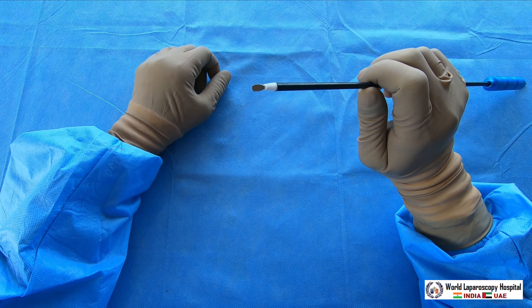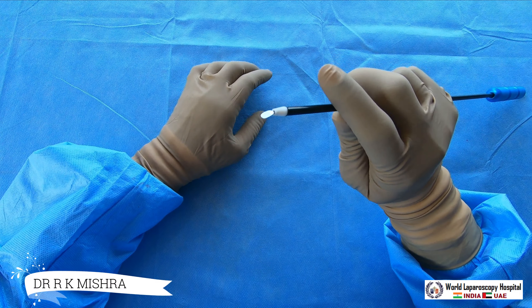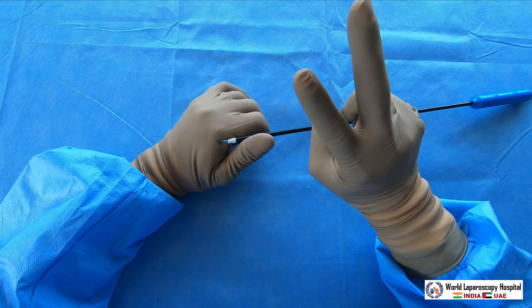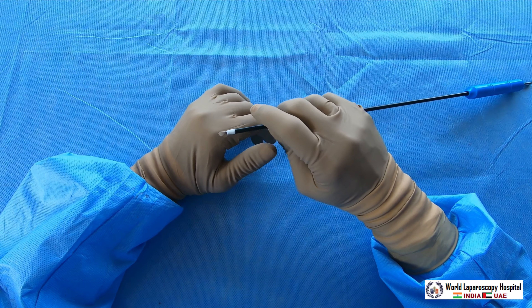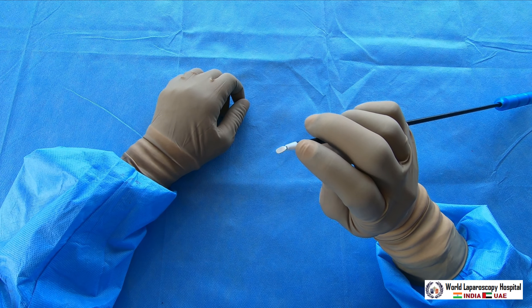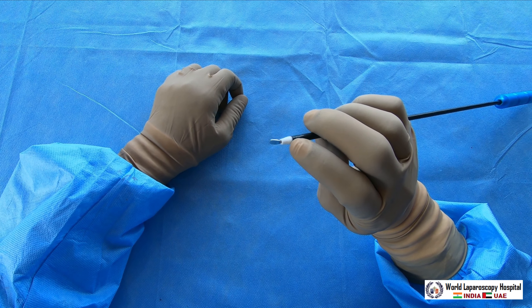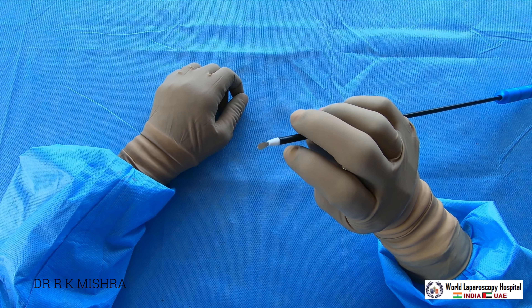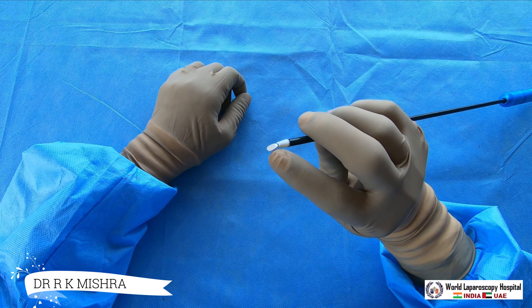Many times when you have bleeding from the bed of the gallbladder, this spatula can be used to do fulguration. Coagulation is of two types: one is called fulguration and another is called desiccation. Fulguration is a coagulation current from some distance, also called spray mode. You have to change your electrosurgical generator to spray mode, and then just brush with the back of this spatula — if you have bleeding or small oozing, that will stop.